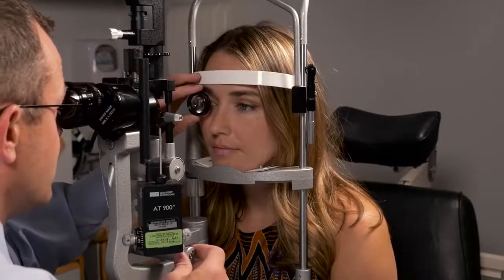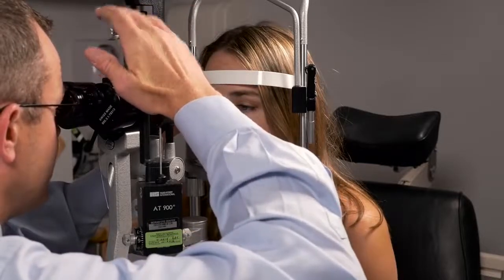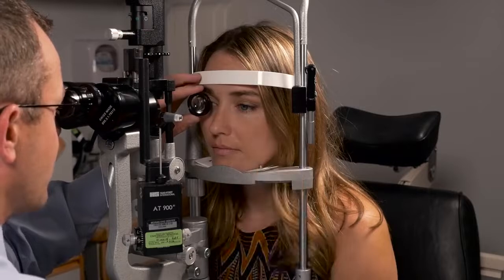When the patient is dilated, it's much easier to do. On a non-dilated patient, it takes a little bit more side to side and up and down movement to be able to get the nerve and the retina and the macula into view and into focus. So first things first, now that I've got the nerve and the macula in focus, I'm going to narrow the beam, shorten it, widen it just a hair.